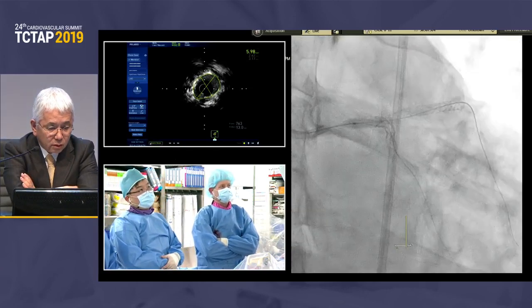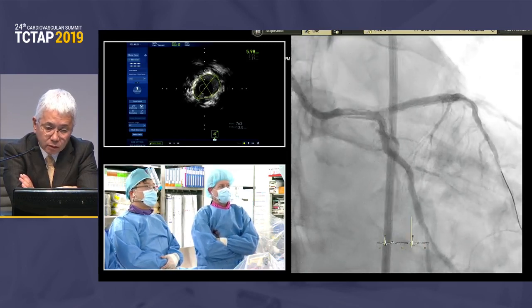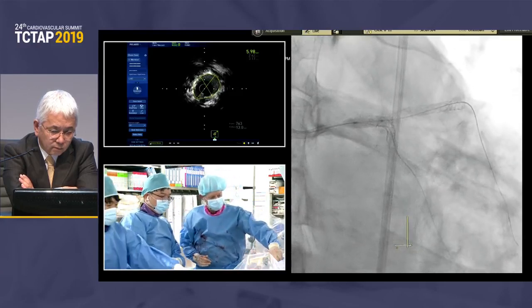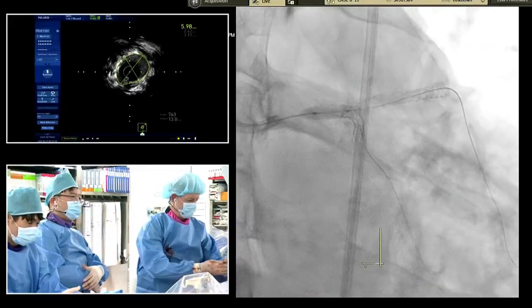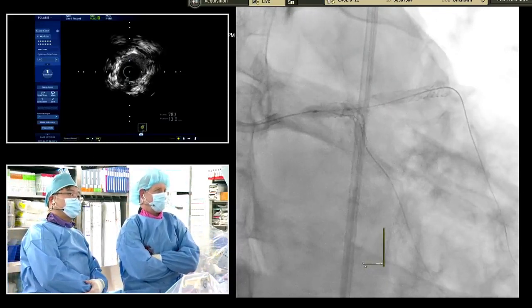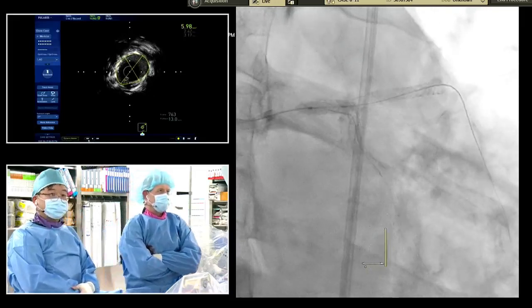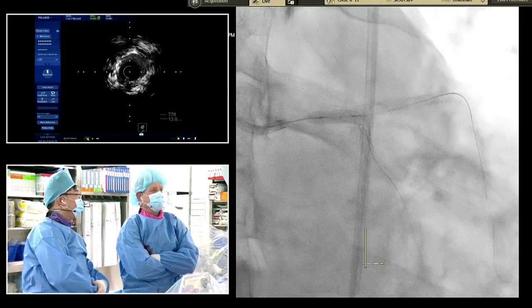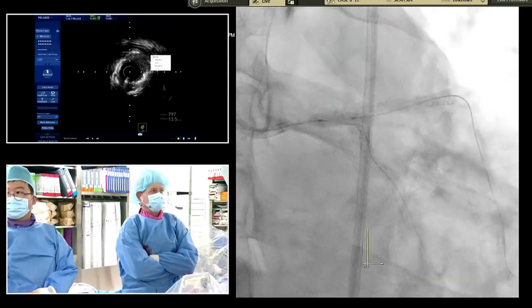It's just the ostium. Which technique was performed for this previous stenting? Crush? No crush, T-stent. We have insufficient information from the outside hospital. Yeah, it was 8 years ago at an outside institution, so we don't know the first technique. But the question to the panel, is this adequately prepped to now treat with the DCB? There's still considerable ostial stenosis, isn't there? What did we get as a measurement? Maybe about 6, the LAD ostium MLA is 6.